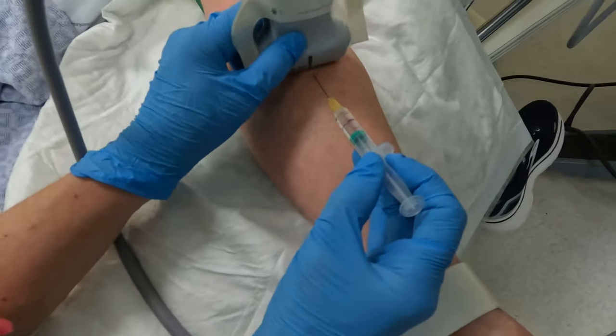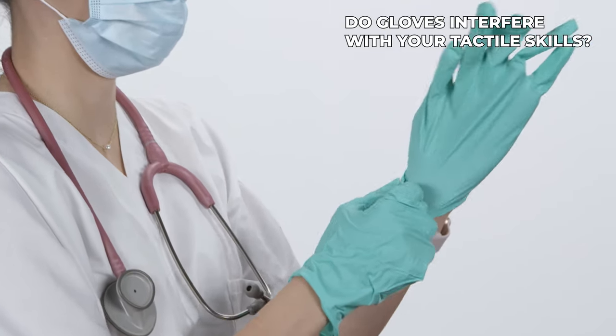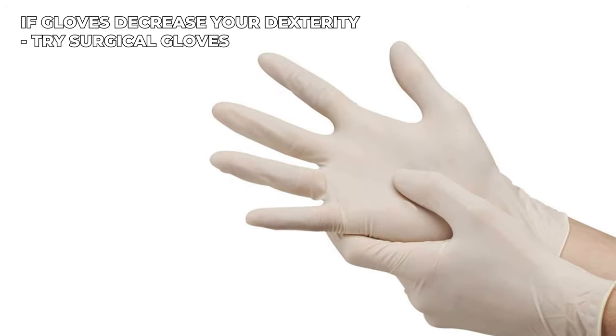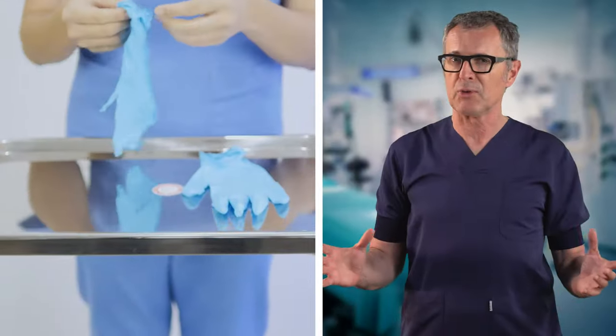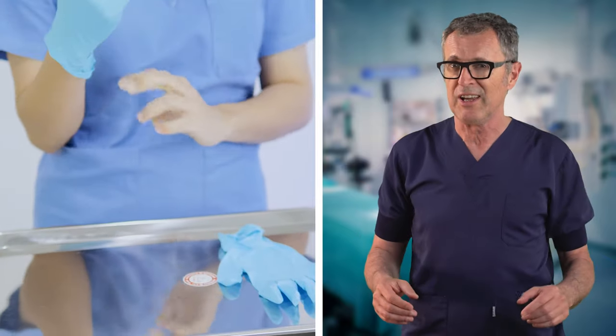In an ideal clinical setting, all practitioners would consistently wear gloves for infection protection measures. However, it is worth noting that glove use may impact tactile sensitivity, which can add a layer of complexity to cannulating peripheral veins. The use of tightly fitting sterile gloves, such as surgical gloves, may enhance tactile sensation compared to standard gloves. However, these gloves could be cost-prohibitive for some, or others might find them still inhibitory, causing them to miss more veins than they typically would without gloves. While it is crucial to promote consistent glove use and a sterile approach at all times, it is also important to acknowledge the challenges that wearing gloves can present in actual clinical practice.